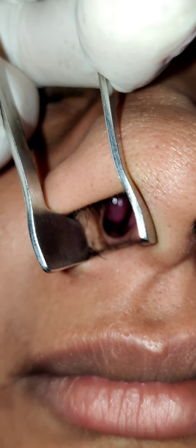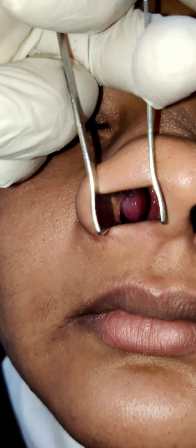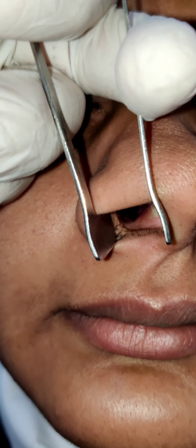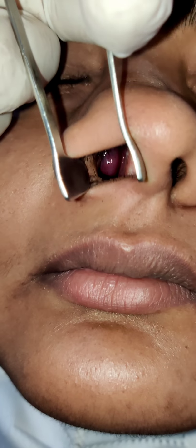In this, you can see the anterior end of the inferior turbinate. In some patients, we are not able to see anything beyond the inferior turbinate. There are two methods of widening this nasal vestibule. In both ways, we can dilate the nasal vestibule. So, this is the floor of the nose, septum of the nose, inferior turbinate anterior end, you can see.